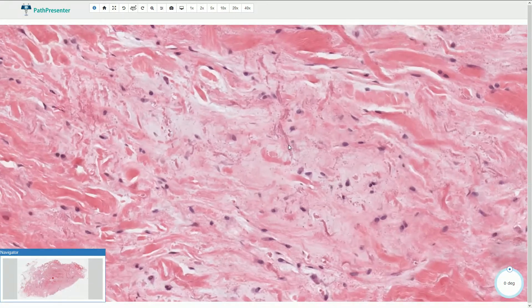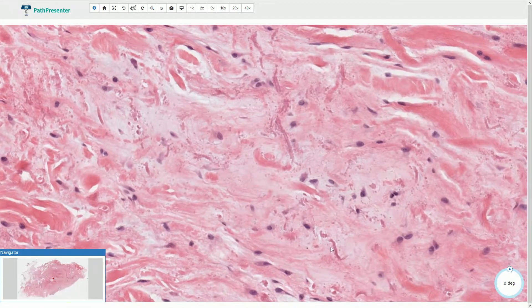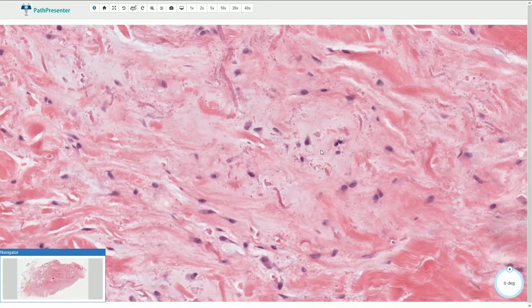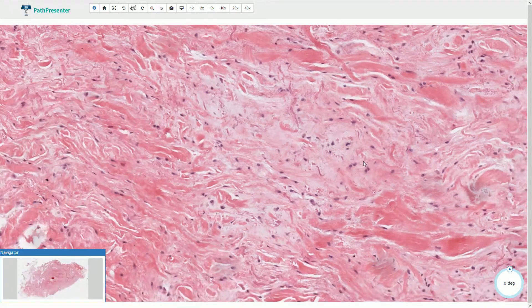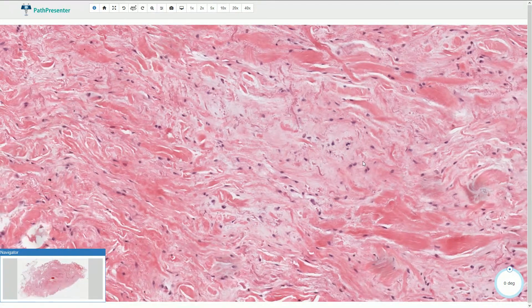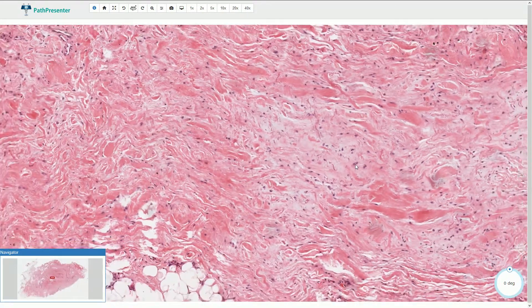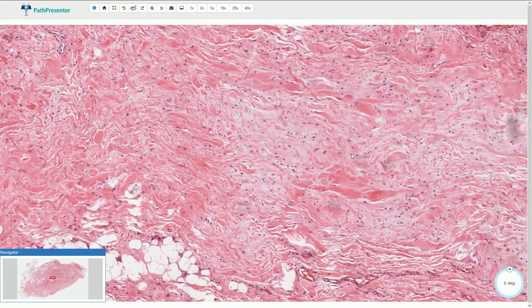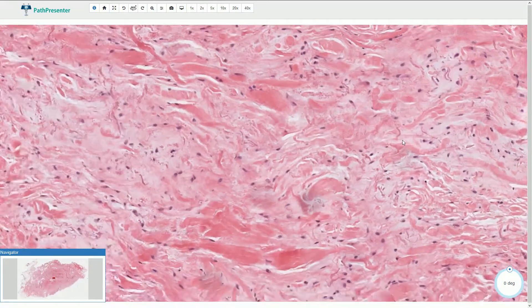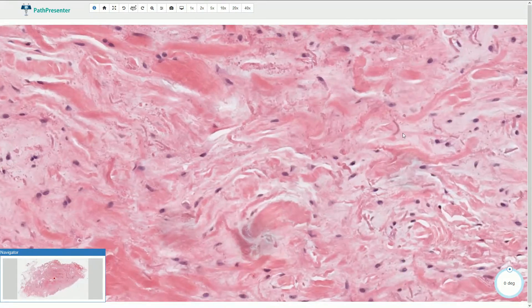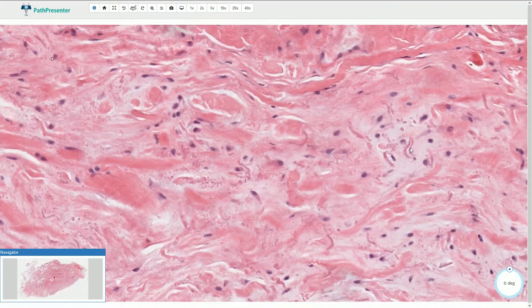The elastic component has a slightly darker color — you can see it here, something like a deep purple color. But in some cases special stains are very useful, so we can use elastic stain or Fuchsin stain to visualize these abnormal elastic structures.